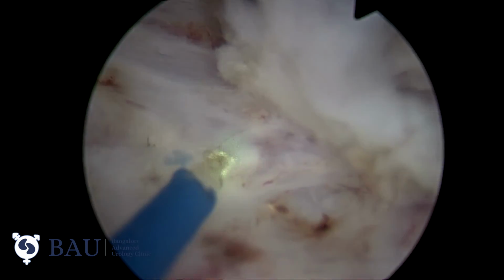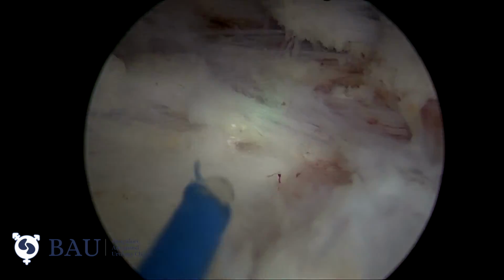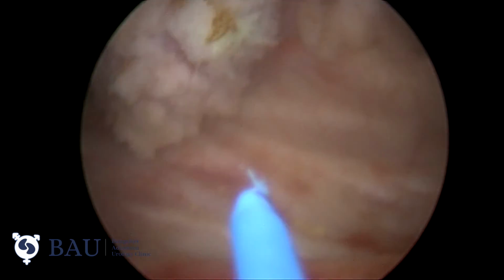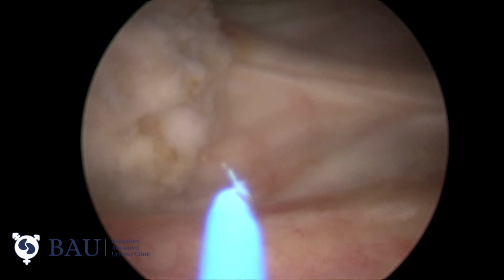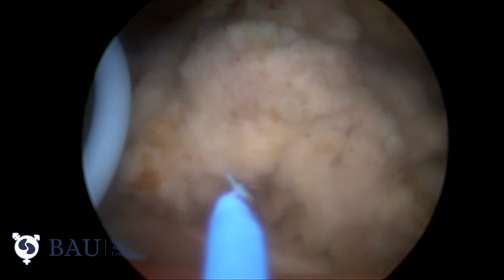We should not coagulate aggressively near the apex. Apical mucosal bleeders will eventually stop. I will reconfirm the ureteric orifices, and once we achieve almost complete hemostasis, now we'll proceed to morcellation.